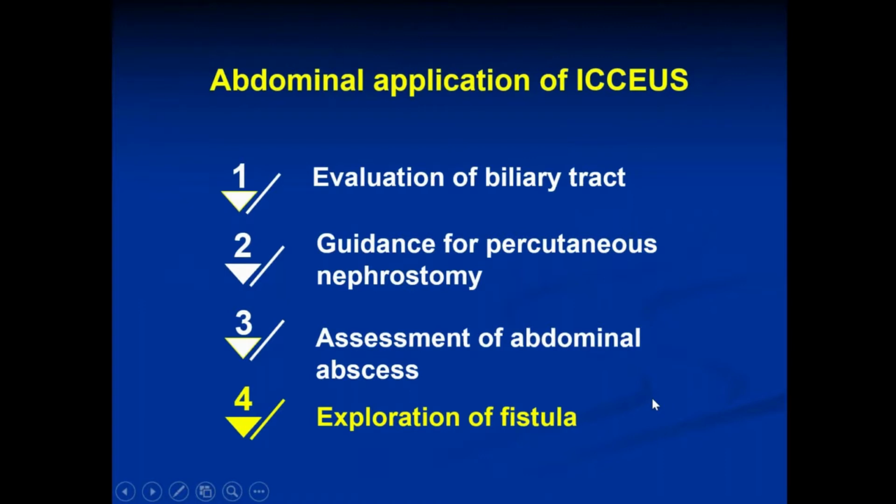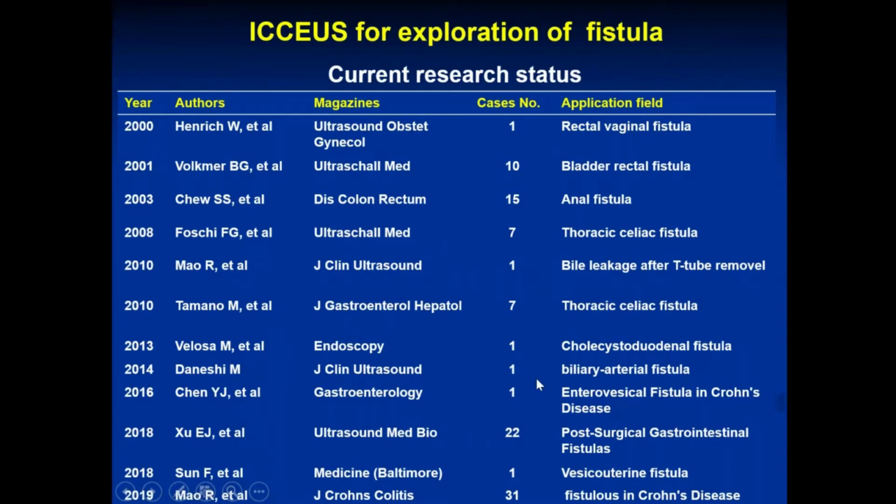And the last abdominal application field of ICCEUS is the exploration of fistula. Now, there are only a few published research papers about the theme of ICCEUS for exploration of fistula. Most of them are case reports.